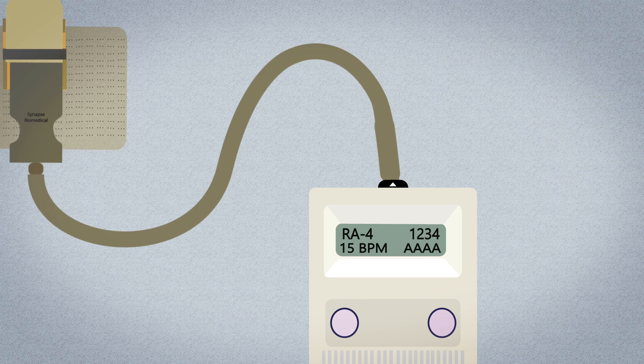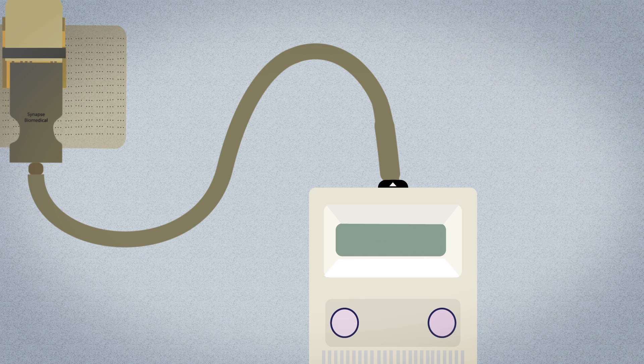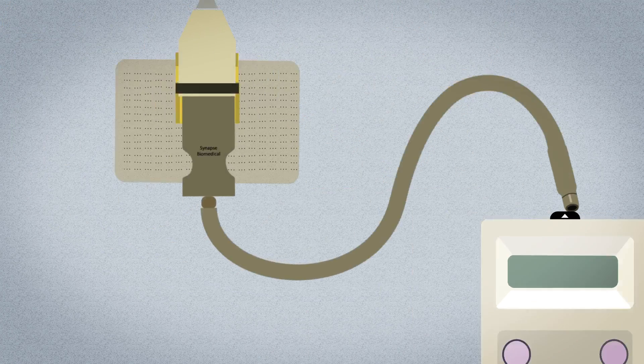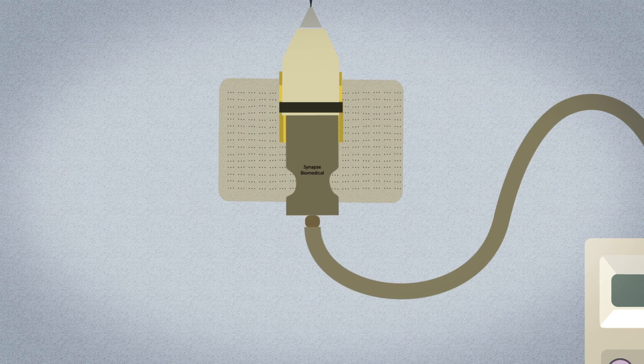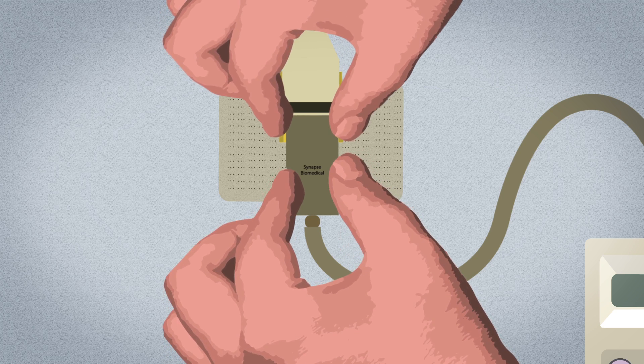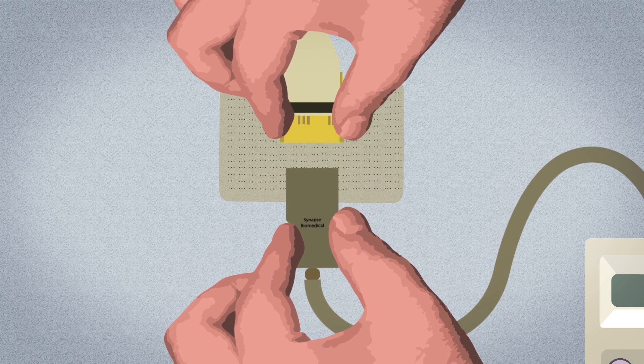When the conditioning session is over, press the two buttons at the same time to turn the Nurex EPG off. To disconnect the patient cable from the Nurex EPG, firmly hold the EPG in one hand, grasp the cable with two fingers, and pull. To disconnect the patient cable from the electrode connector, hold the electrode connector between two fingers and gently pull the patient cable out of the connector holder. Store all items in the patient kit provided.